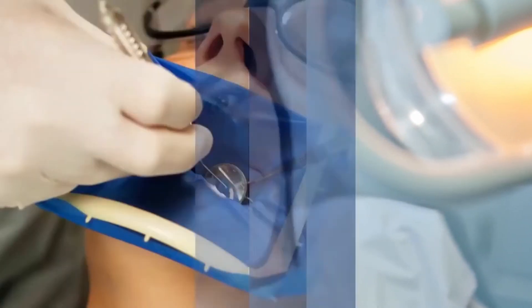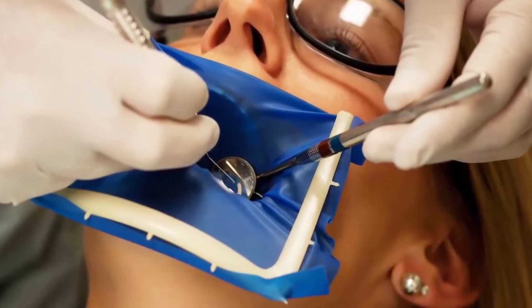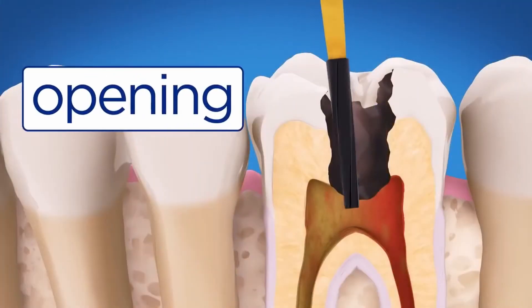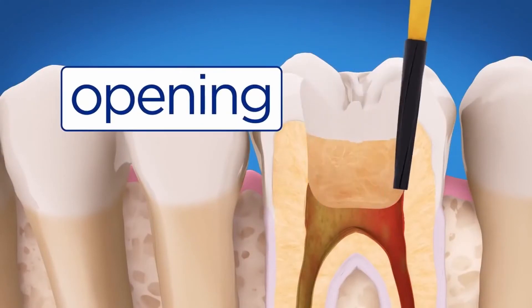Here's how root canal treatment works. First, your endodontist will numb the tooth so that you won't feel anything during the procedure. A small shield isolates the tooth, keeping it dry and clean. An opening is made through the crown of the tooth and into the pulp chamber.